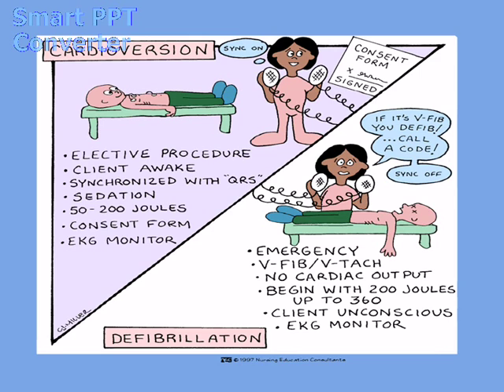So to actually cardiovert, you have to activate the synchronizer button in addition to charging the machine. So you press the sync, you press the charge machine, and that allows for the shock to synchronize with the client's underlying rhythm. It turns the eyes on, so to speak, so that the machine can see that upright QRS complex. If we don't do that, we could shock the patient and put them into a lethal dysrhythmia and cause ventricular fibrillation. So during cardioversion, there must be synchronization.